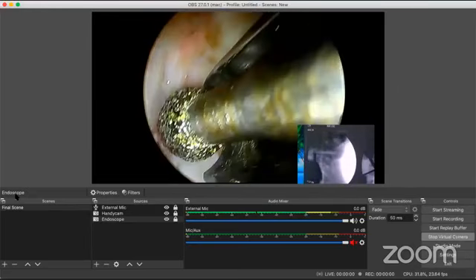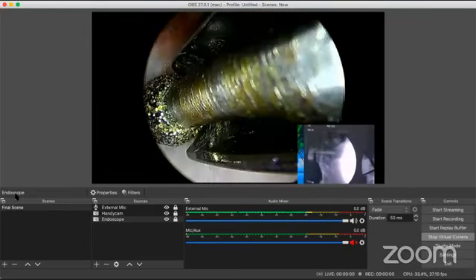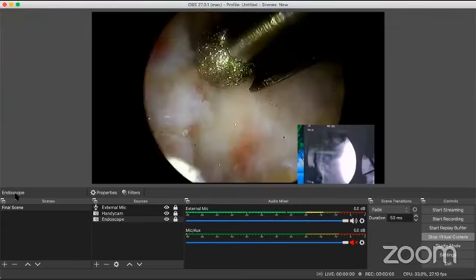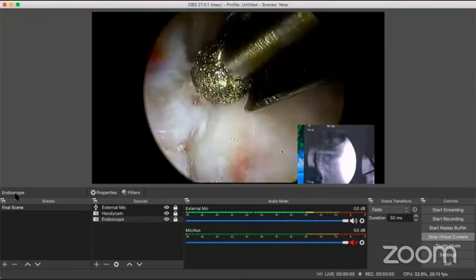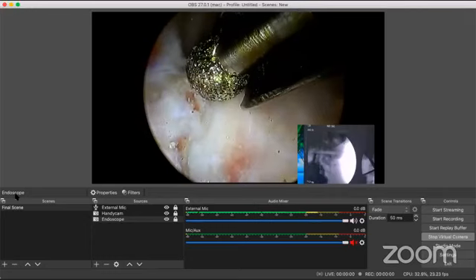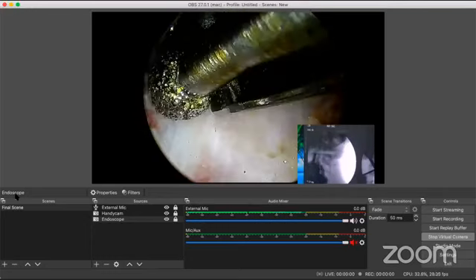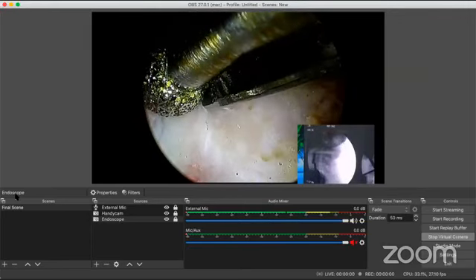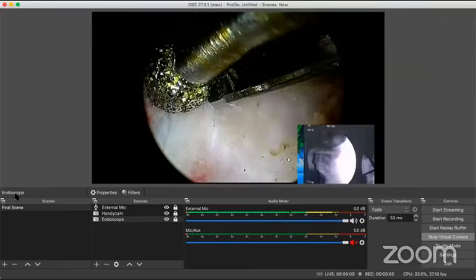Oh, my hands are coming on. Yeah. Now the scope is always behind. So sorry. Yeah. Shoot again. Yeah. Now you can see that I'm on the medial edge of the vertebral foramen.